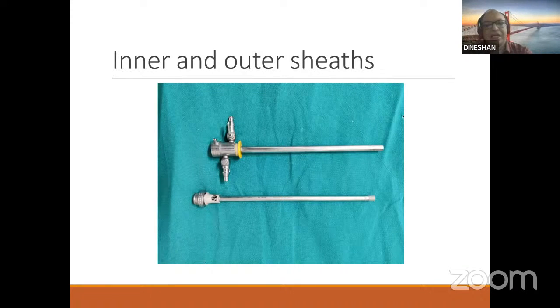And while assembling this resectoscope and while doing the procedure, always make sure that the outflow is proper. See that the outflow channel is open and it is flowing continuously. If it is not, you stop the procedure, remove the scope, remove the sheath, and verify that there is no clot in the outlet channel. Flush it, and always see the tip of the outlet sheath where you can see those small pores, small openings.